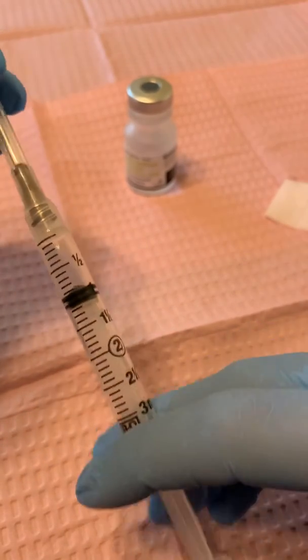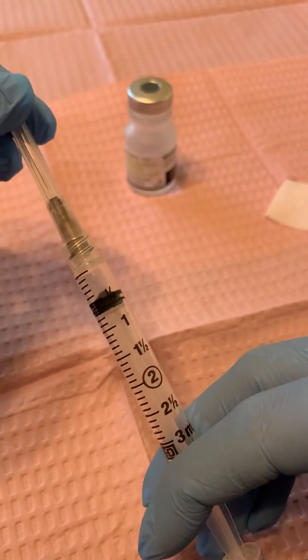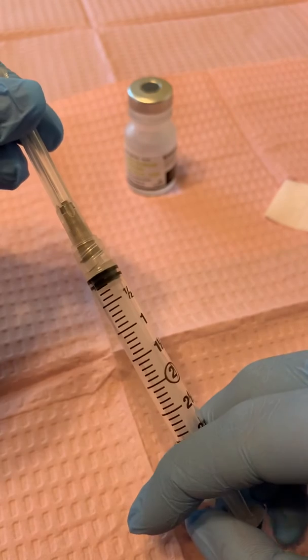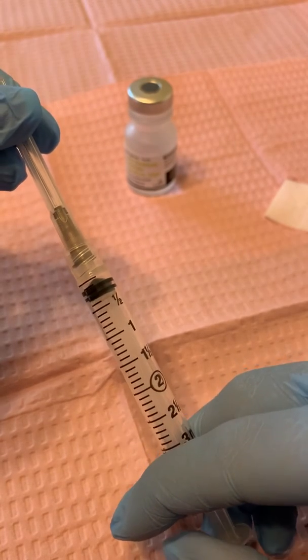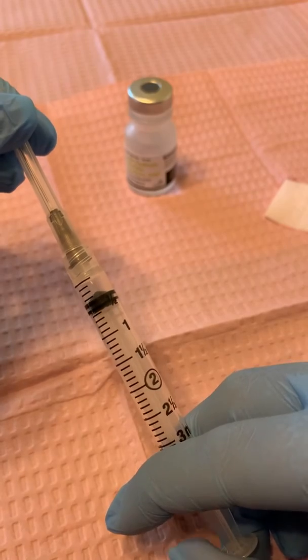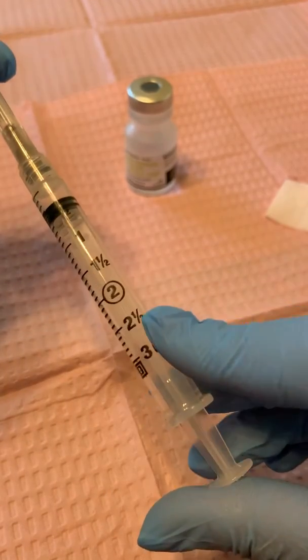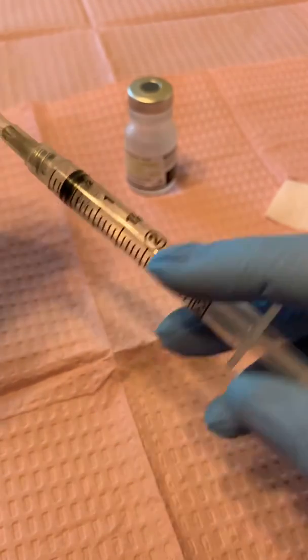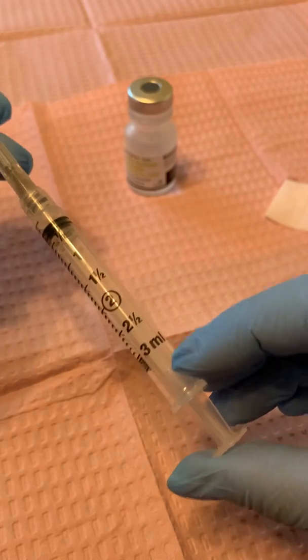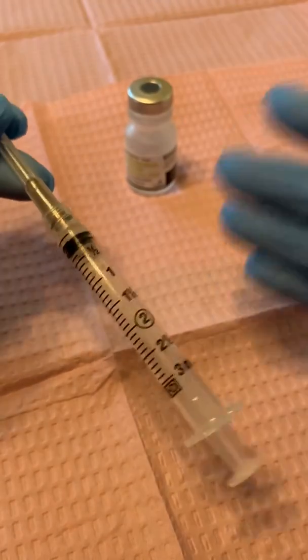For example, if the doctor ordered 0.5, we would go right to 0.5 there. If the doctor ordered 0.3, start right at the black and go 0.1, 0.2, 0.3. And then we have 1, 1.5, 2, 2.5, and 3. We also have other syringes that go up to 5 cc's, 10 cc's, 20 cc's, 60 cc's — again depending on where you work.